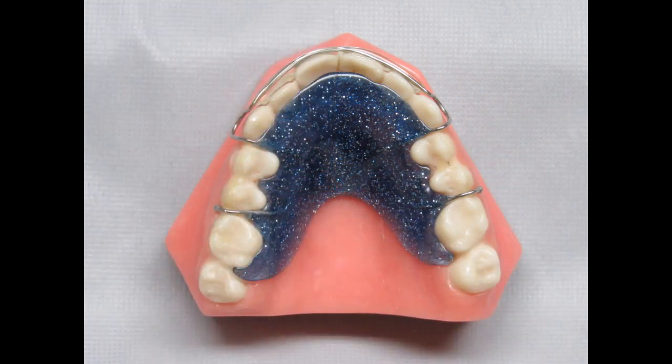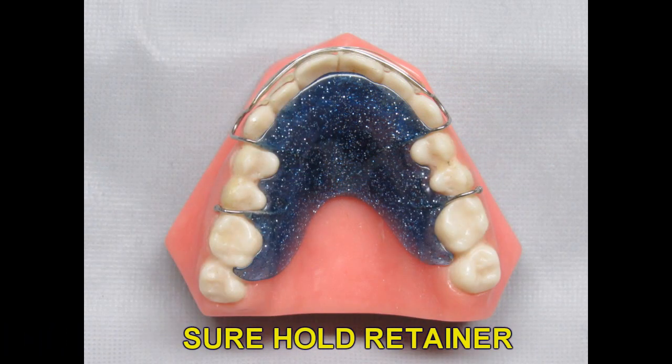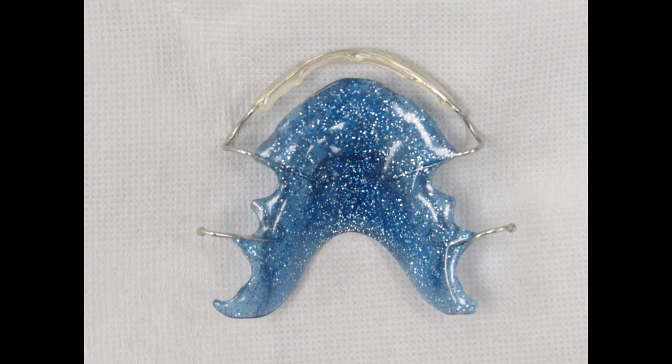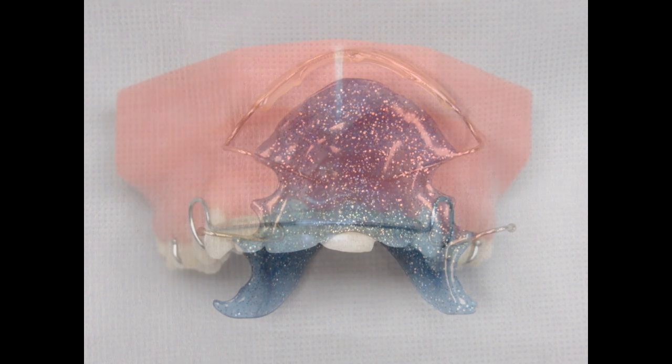In some cases where you want maximum retention of the anterior teeth, a sure hold retainer is a great option. This appliance can be made on the upper or the lower arch. Instead of the standard labial bow, we cover the wire with acrylic and contour it to the facial of the teeth and the embrasures. If you had to rotate teeth during orthodontic treatment and you want to prevent them from rotating back, the sure hold retainer will hold the teeth on the facial and the lingual to prevent relapse. The sure hold retainer provides maximum retention for the anterior teeth.